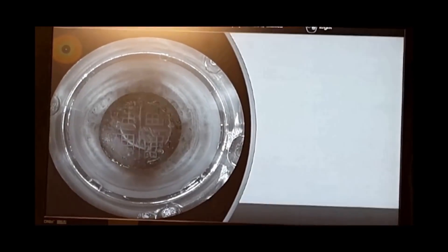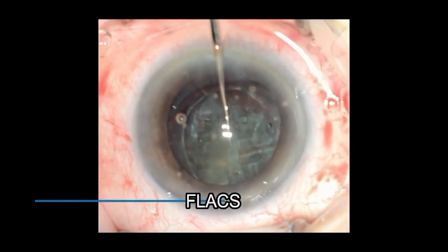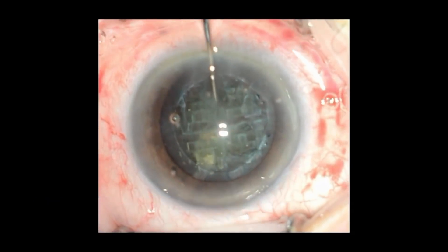Jacobovitz Chopper may help significantly in splitting incomplete fractures in femto cataracts.